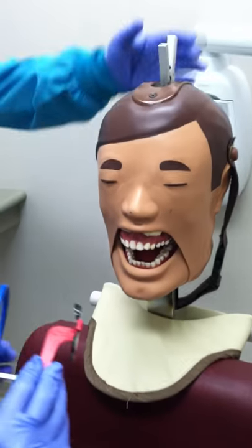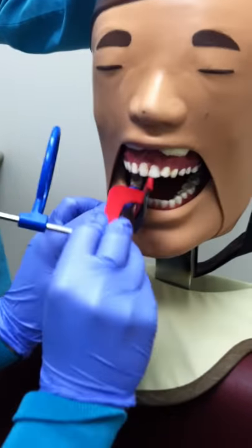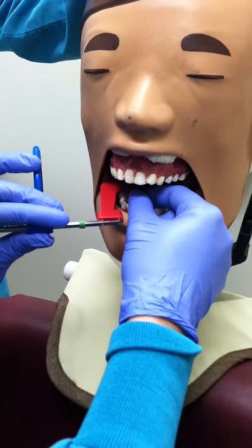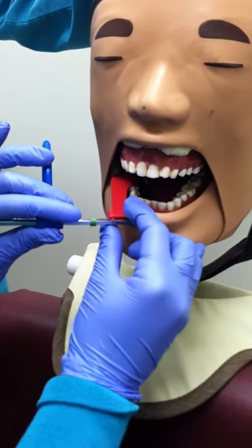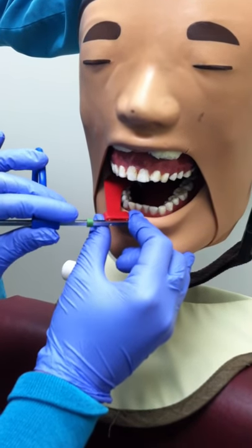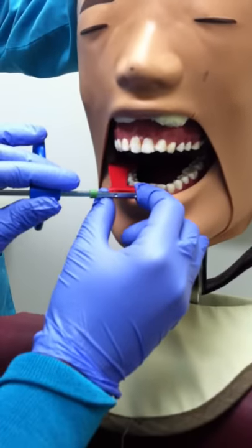Insert the phosphor plate into the mouth so that it captures the first molar, second premolar, first premolar, and the distal of the canine. When lining up the phosphor plate, make sure it is lined up with the mandibular arch so that the phosphor plate and the mandibular teeth are parallel with one another.